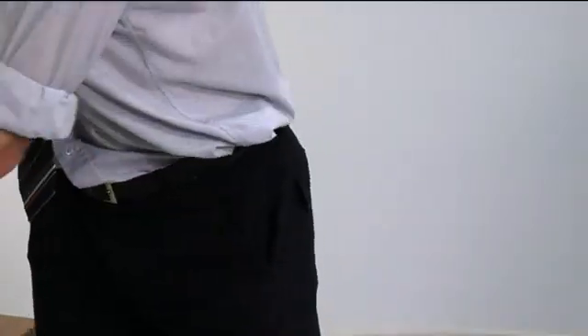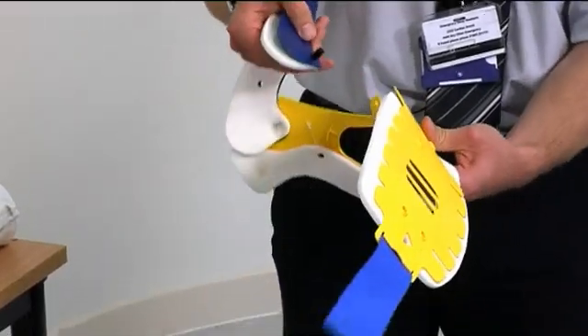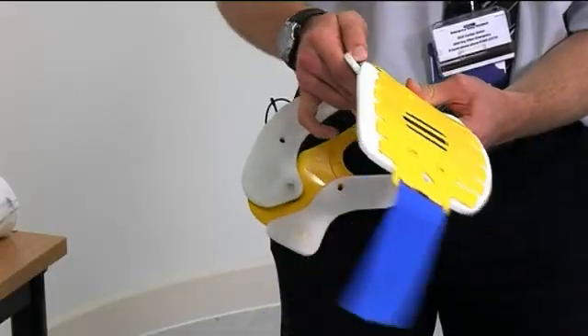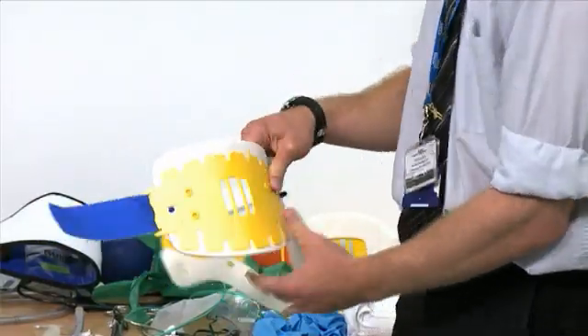Some collars come flat-packed, in which case they need to be assembled. This is done by fitting the black stud through the only ring through which it will fit, and also producing a kink in the back of the collar for ease of insertion.